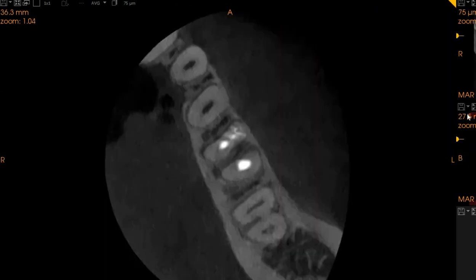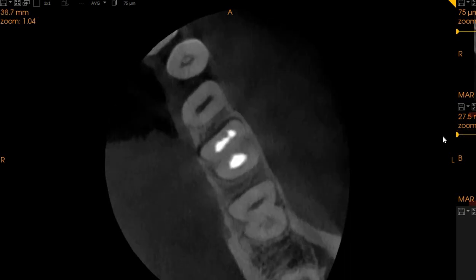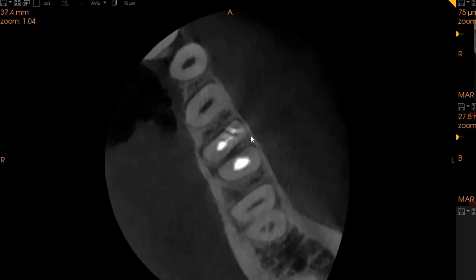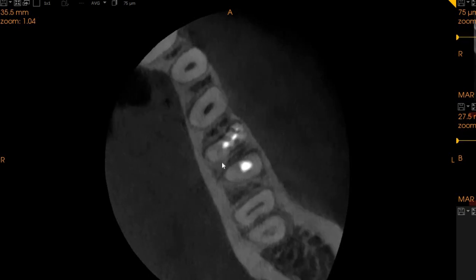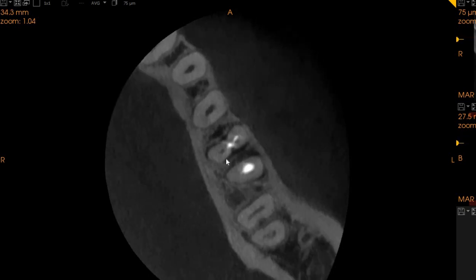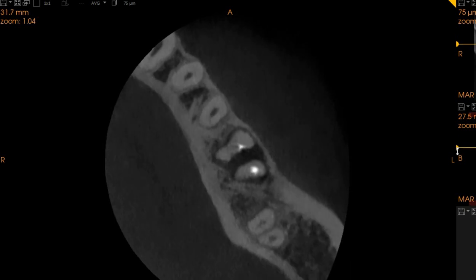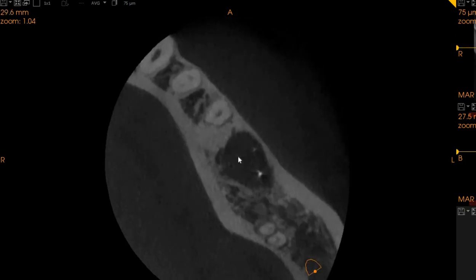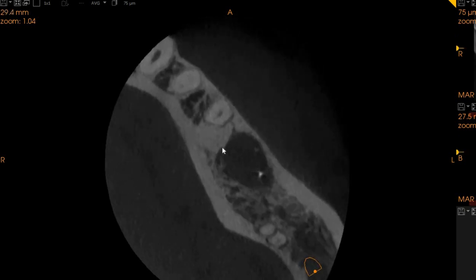Now, looking at the roots from an axial point of view — on the axial view, we can see that this is the obturation. Here, this is the crack on the mesial buccal aspect, and then as we're moving inferiorly, we can see that the mesial lingual canal has not been obturated properly either. This is the radiolucency which is extending all over.